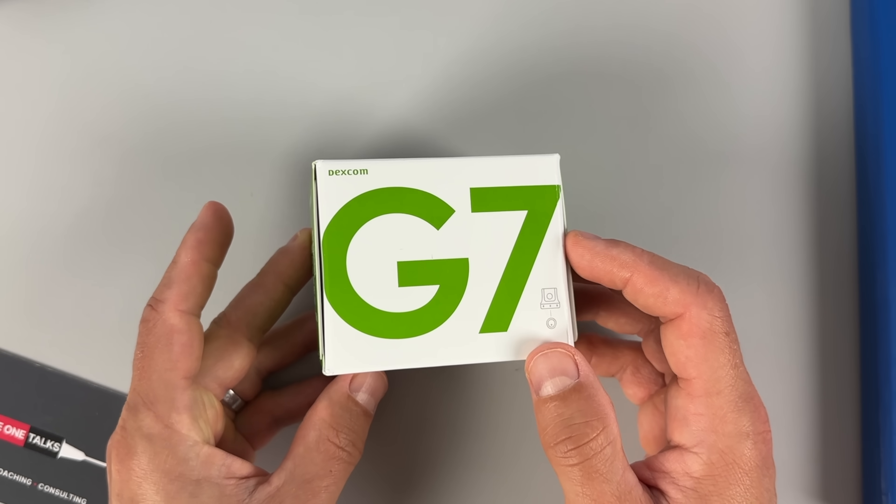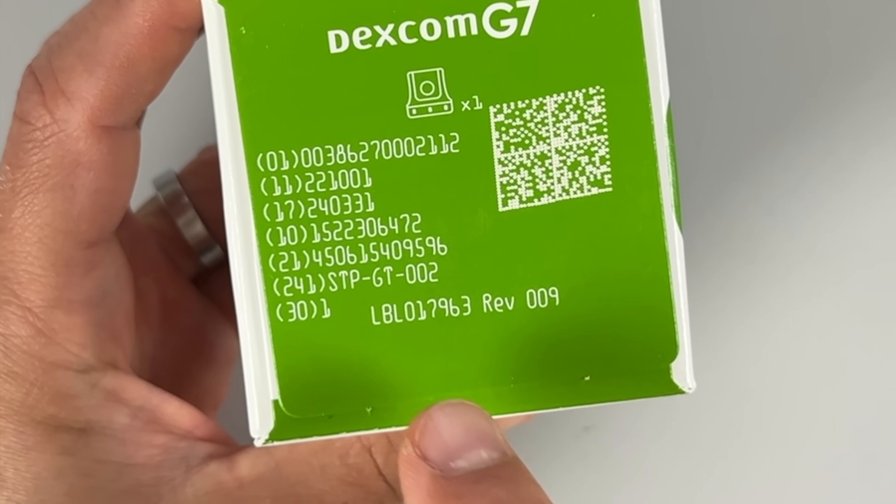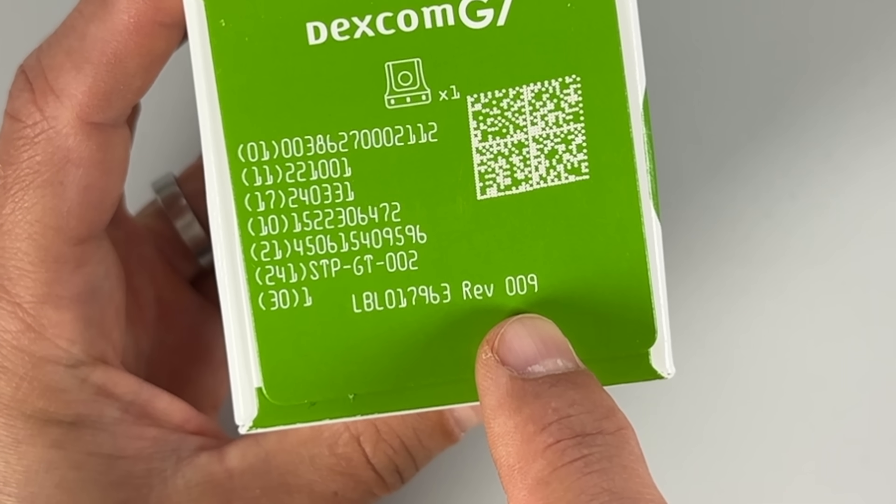Now you might be asking: how do I know that my sensor already has the enhanced Bluetooth configuration? Honestly, I don't know this 100%, but rumor has it that you can tell by the LBL number. Some people say that it needs to be REF 010 and higher for the number that's not underlined, and if your number is underlined, it needs to be REF 004 and higher. I'm not really sure and I don't want to spread misinformation, but my gut feeling is that you should be receiving the upgraded version from your distributor from now on.